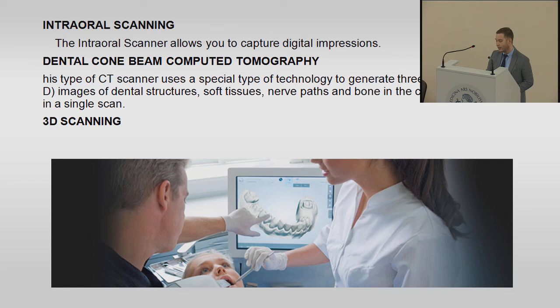So in our method, what we're trying to do is combine the CBCT to get all the root part of the teeth and as well all the bones, and combine it with a great model that we took with impressions, like the traditional way. How do we convert a CBCT file to a 3D model?